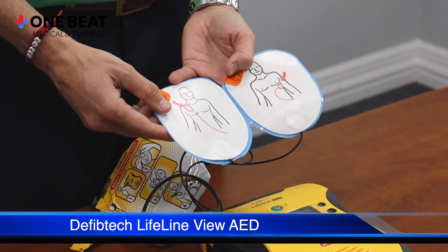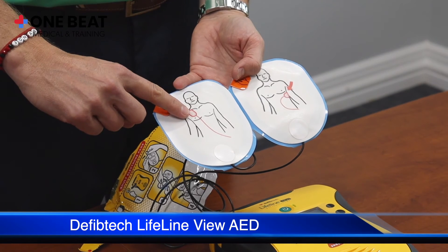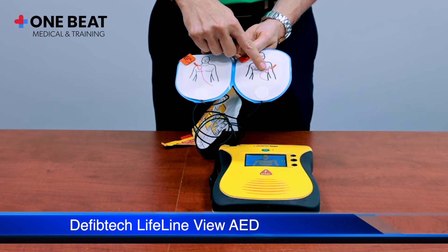Each electrode has an image of where the pad should be placed. Upper right — remove clothing from patient's chest.